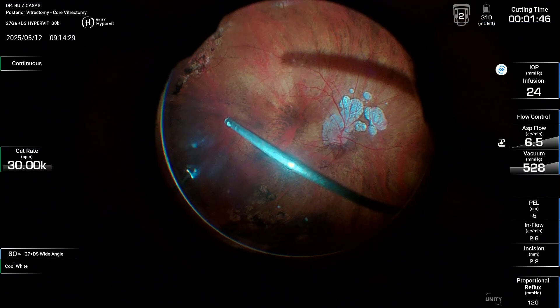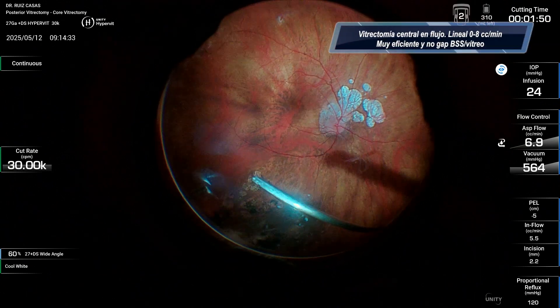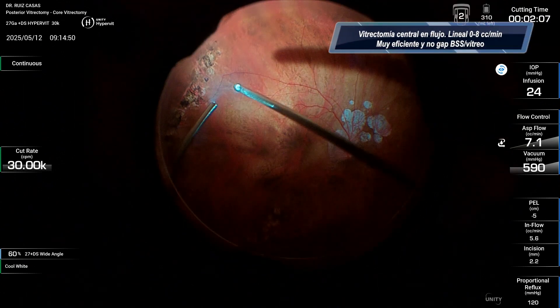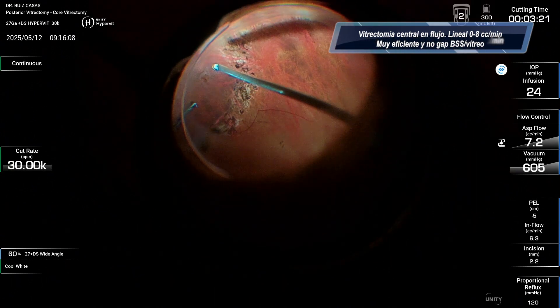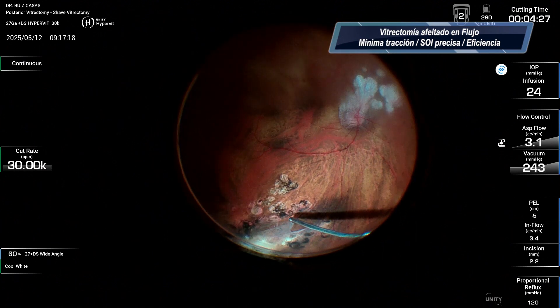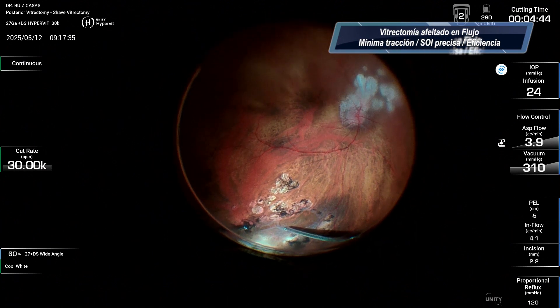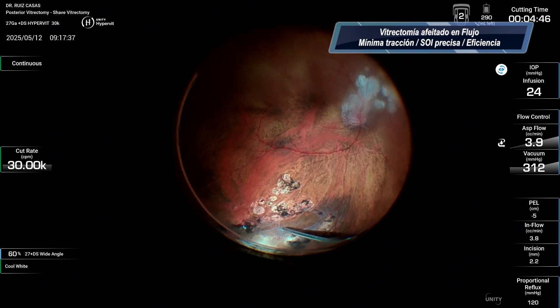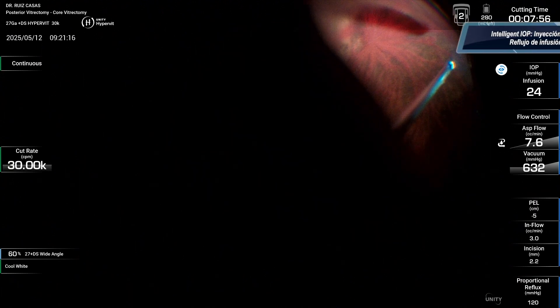But the most important thing of this system is the new pump. This new pump is a peristaltic pump, although you can also use a real venturi pump when you are working under air, and it helps you to perform vitrectomy in a really controlled manner with perfect control of the flow, reducing the risk of retinal trauma.